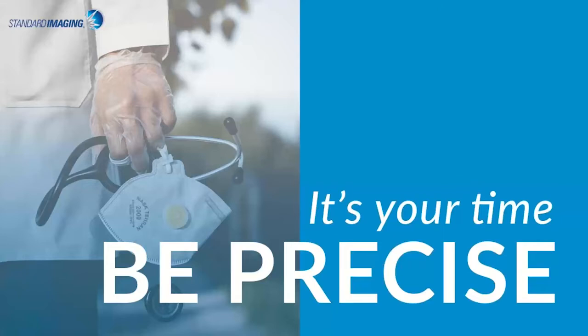Amidst all this change, we know cancer doesn't stop and that patient health issues will continue to be at the forefront. So as medical physicists, we understand that your time is extremely valuable. So we truly work to design, develop, and manufacture QA solutions with that in mind. We are here as your partner for efficient and precise solutions, whether they be for daily, monthly, or annual QA, or as we're going to discuss today, the management of all of that.